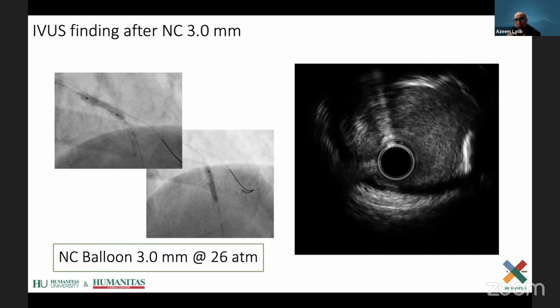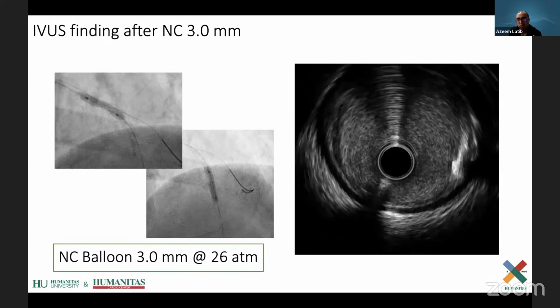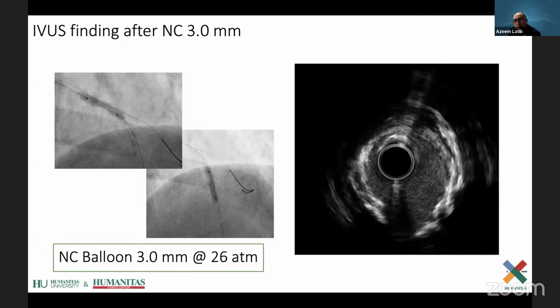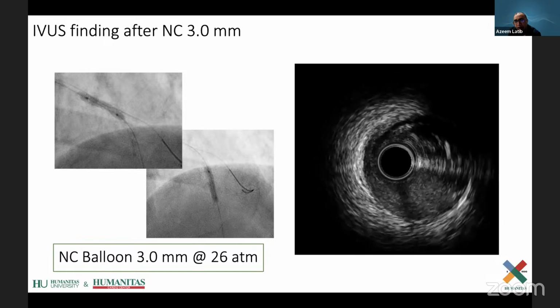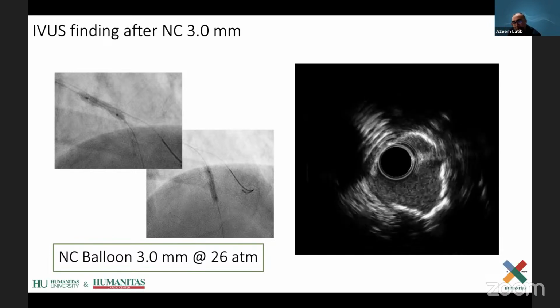They tended to have more end-stage renal disease and hemodialysis, and lower ejection fractions. So the outcomes were a little bit more guarded compared to the ones who did well with shockwave alone. I think there's something to be said about those patients.